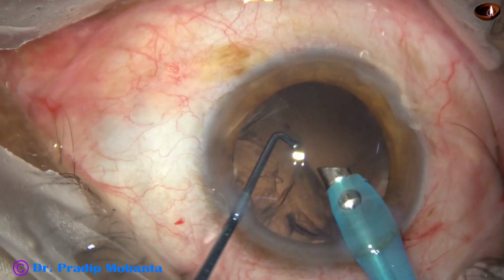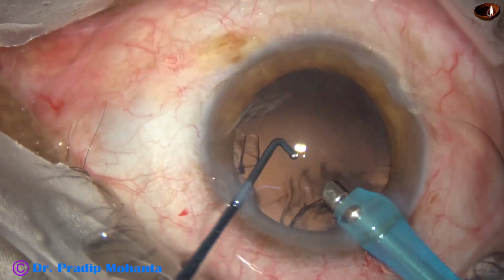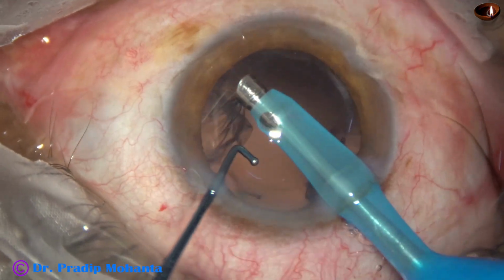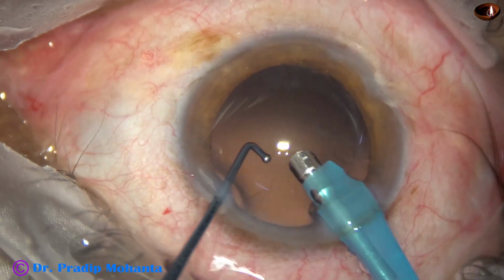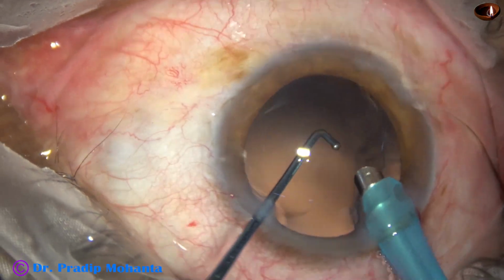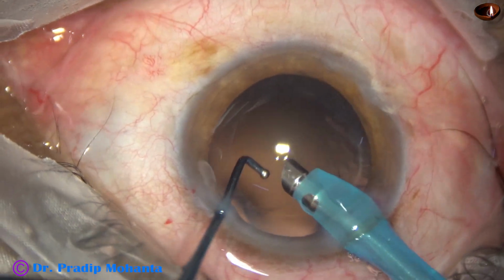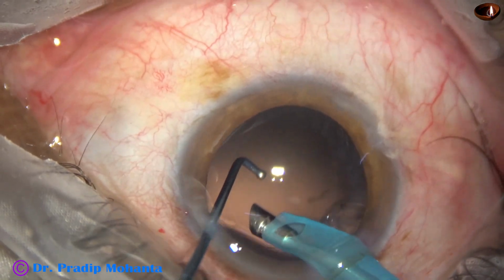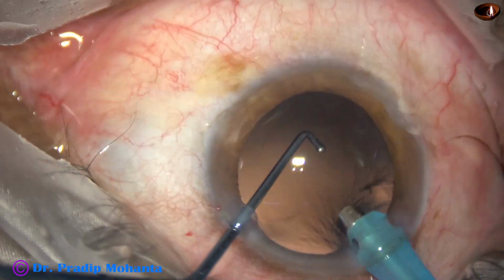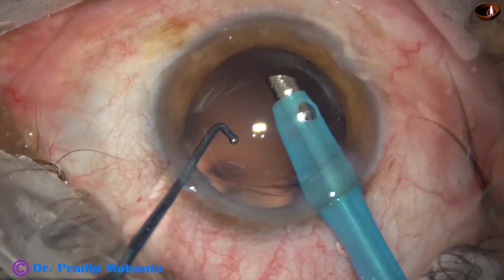Finally, the epinucleus is removed. And now, let us see if we can remove the cortex by the handpiece itself. The machine is in irrigation aspiration mode, and vacuum is 350 and flow rate is 35, and the cortex is being removed by the handpiece. We have to be very careful. We must not catch the posterior capsule, and if we happen to catch the posterior capsule, we must stop immediately, use reflux and release it.